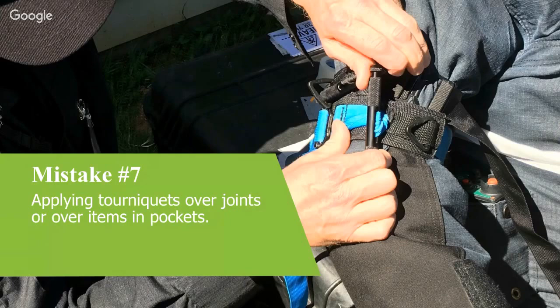On using tourniquets on dogs, we did a lot of training with combat assault dogs overseas, and they got shot and injured regularly. The arteries in the limbs of dogs won't bleed to the same extent as they will in humans. The assessment from the specialist US SOCOM vet was that tourniquets aren't required and a pressure dressing will work instead. It's tough to get a human tourniquet around a dog limb; it just doesn't work well because they're too skinny. So we might move on from there just to keep things flowing.